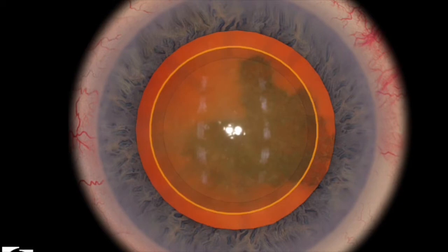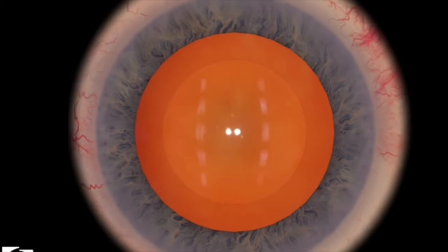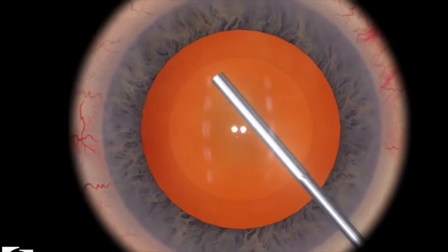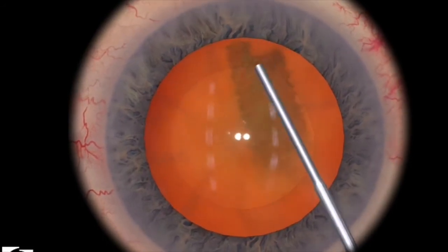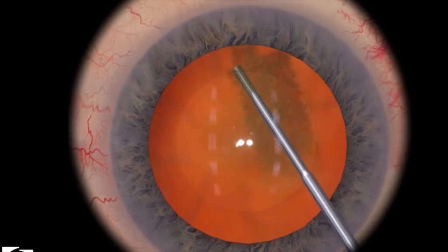Then there's hydro dissection, and then you should be able to spin the cortex. Let's take a look at that one more time. This time I'm actually going to start with hydro dissection, and you can spin the cortex afterward — and that's a good hydro dissection.